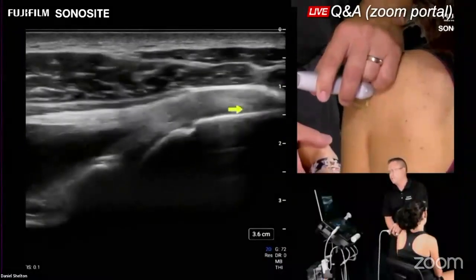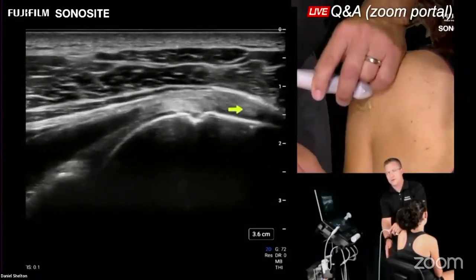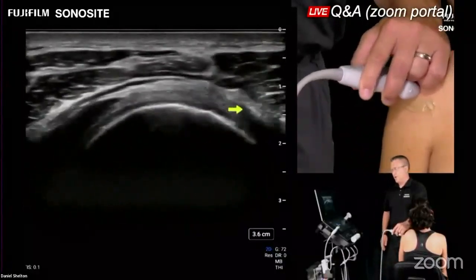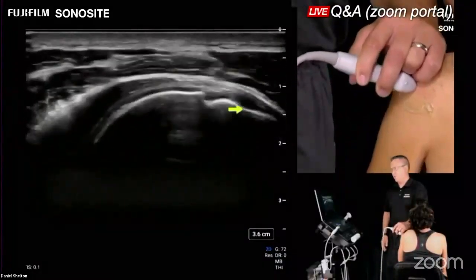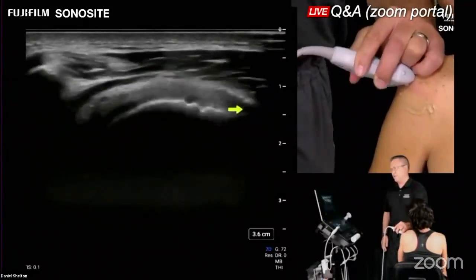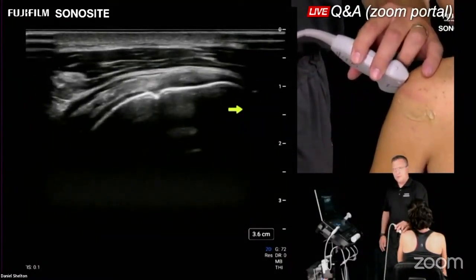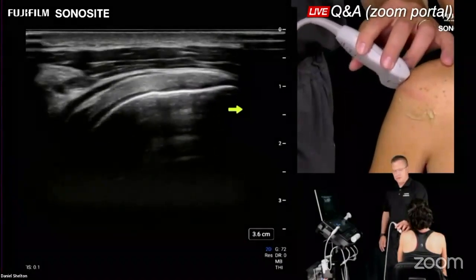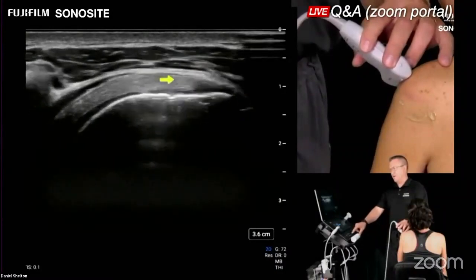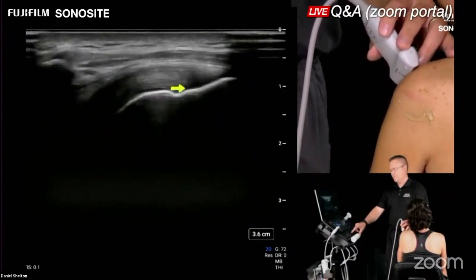I'm going to get off track here. And I'm going to rotate our shoulder for the camera here. That way we can chase this probe direction down all the way anterior, and we're actually just following the enthesis of the infraspinatus so that you get a general sense of just how anterior it goes. Remember, it's the neighbor of the supraspinatus, right? So here I am on the most anterior part of the lateral shoulder, as we did in our lateral shoulder webinar, and you can see that the infraspinatus looks a lot like a supraspinatus, except it doesn't have that inflection point of the greater tuberosity anteriorly.